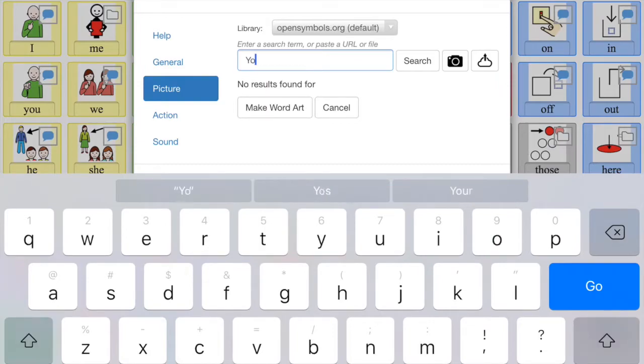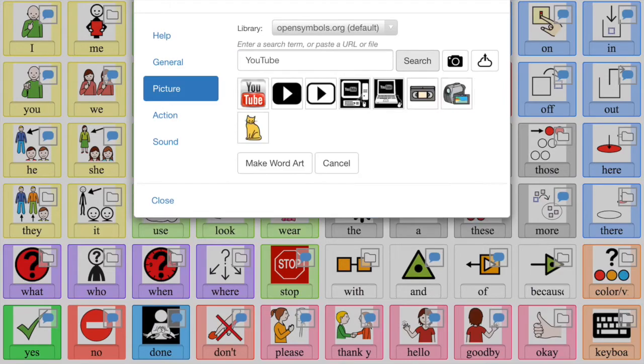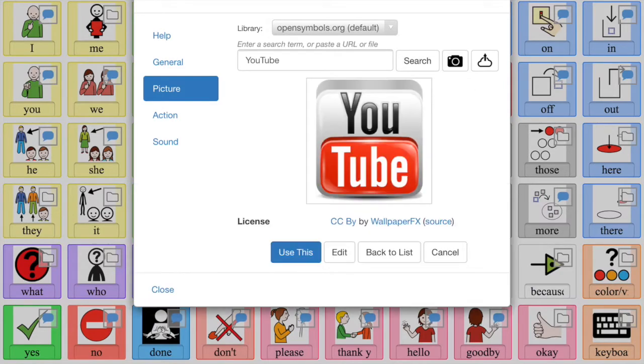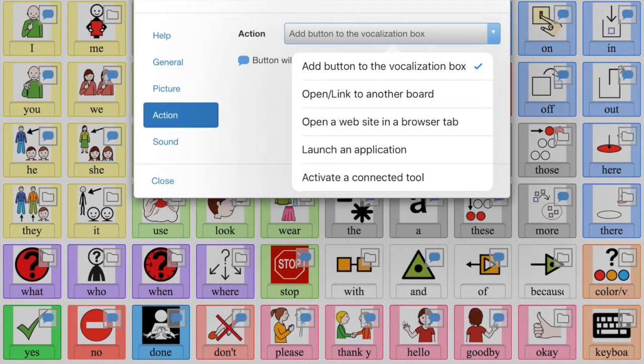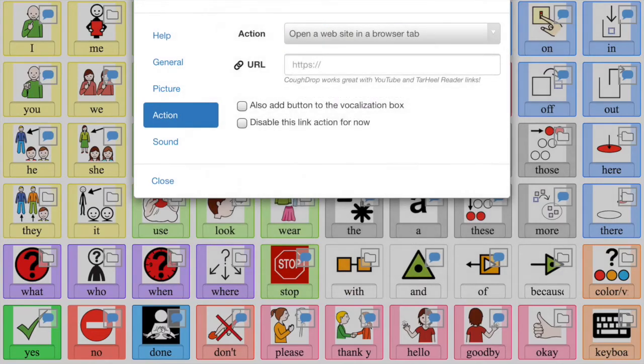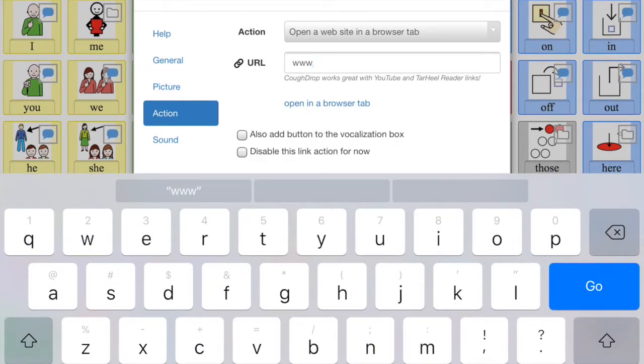I'm going to try to do YouTube, put YouTube on here. I've never done this before, so it is very much a new challenge for me. We are going to action. We want to open a browser tab. So we're going to go to, let's just try youtube.com and see what happens.